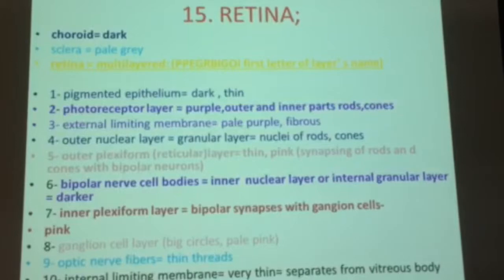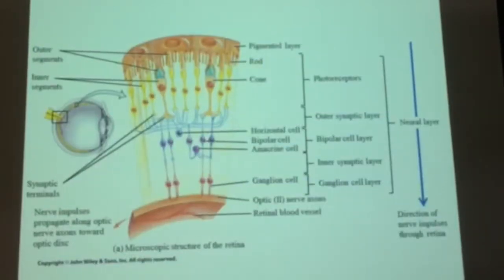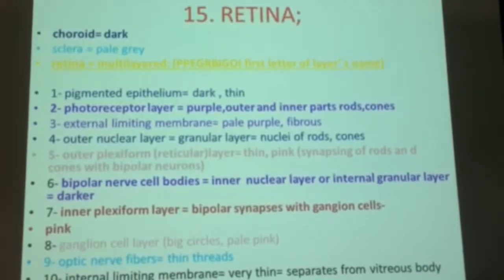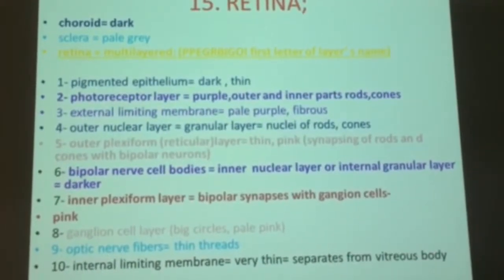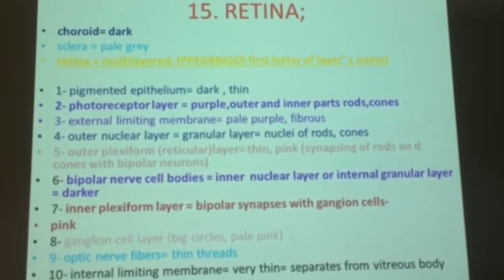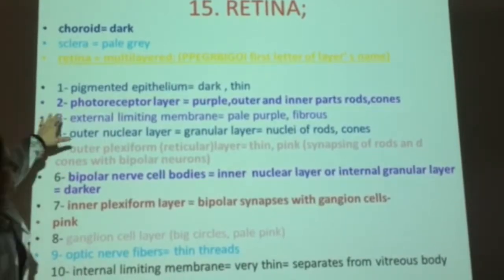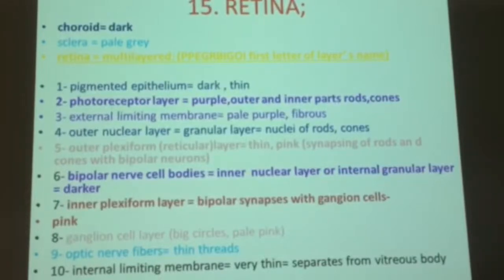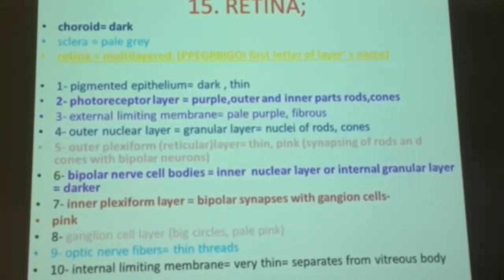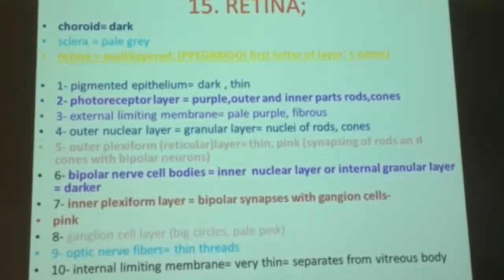Okay, can you go forward? One. No, go back. Okay, so look at this for a second. I know it's shaking here. Sorry about that. So this is going to help you look at that slide. It tells you the photoreceptors, what colors they are, so you can take a look at all of them. I'll leave that up for a second. Of course, you can pause it.